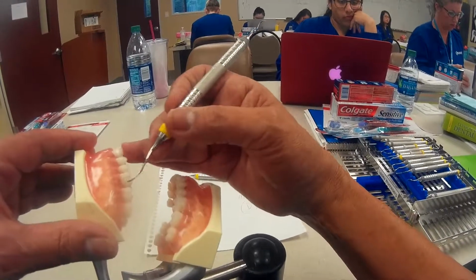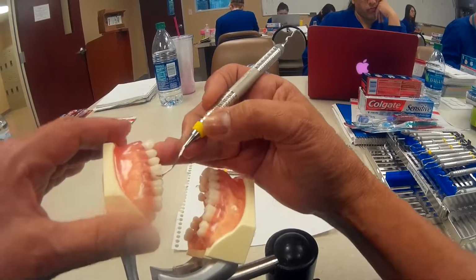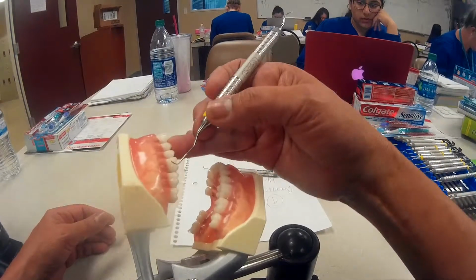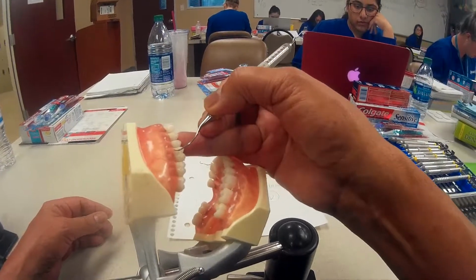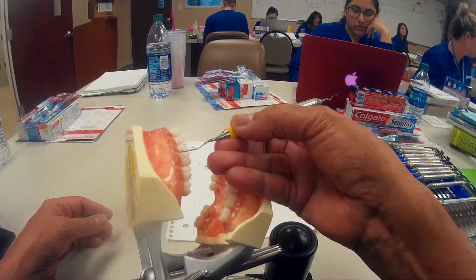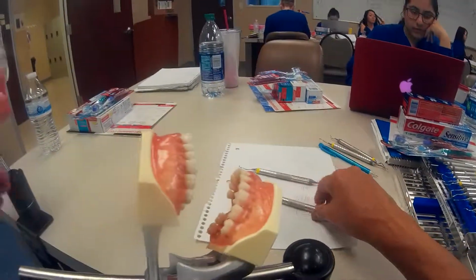Sometimes if an extra oral fulcrum is not what you're going to use, you may find yourself even fulcruming a little bit ahead to get that done so that you would be safe and not be in the line of fire. But at this point, I think I would have to resort to an extra oral fulcrum to make sure that I got that in there safely and kept that angulation correct.